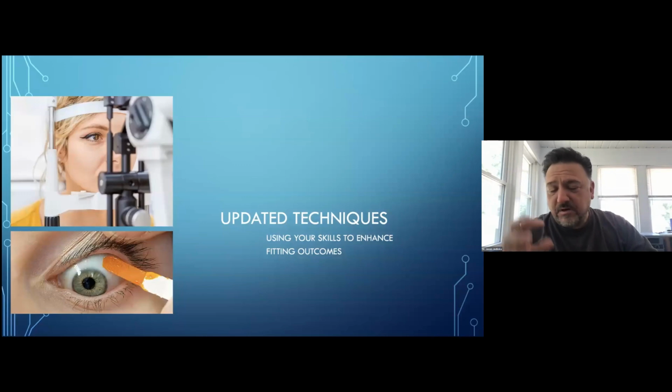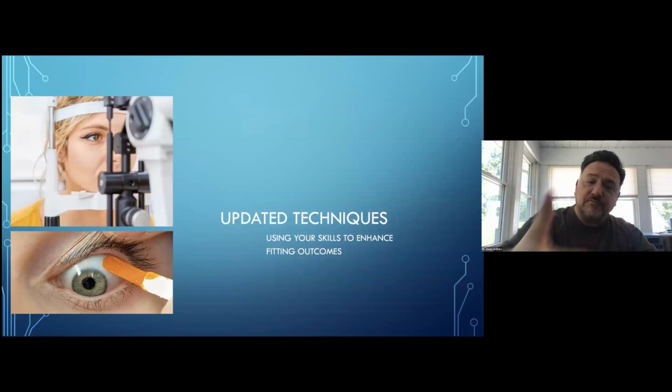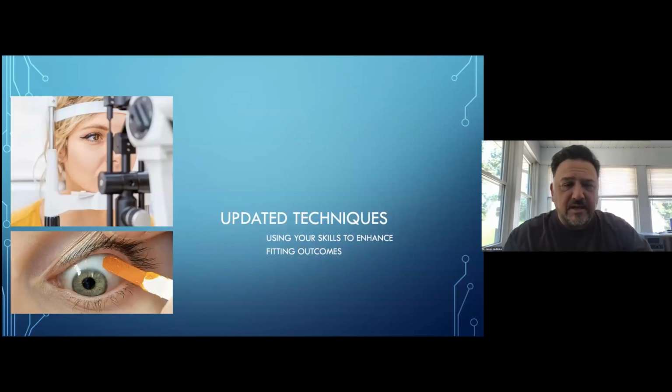So, but the other part of having that instrument, other than just being a more efficient diagnostic lens fitter, is it does allow you to have the capability of doing instrument fitted lenses when you need them or when you feel like they're warranted. So when I've got a situation where I've got a more complex eye, it allows me to have the software to do a more complex design. So having an instrument can be a benefit to your practice as well.